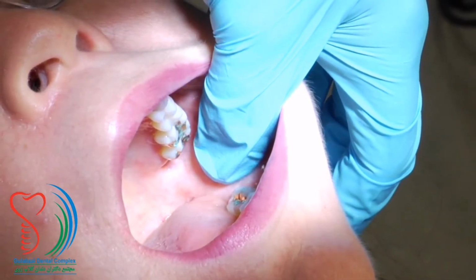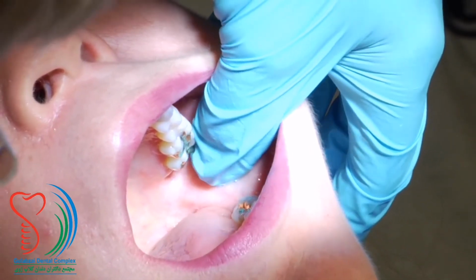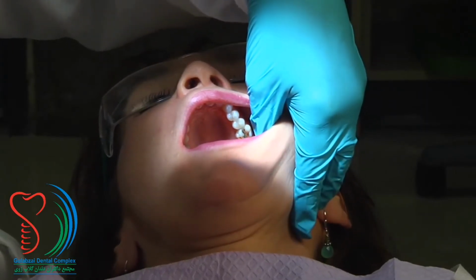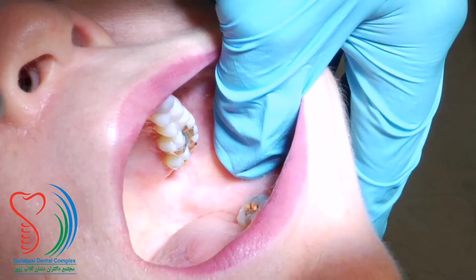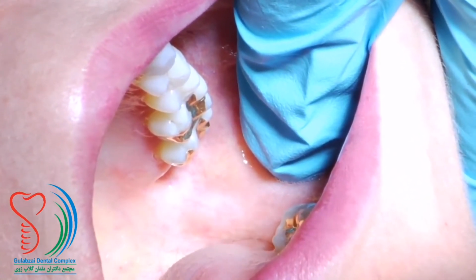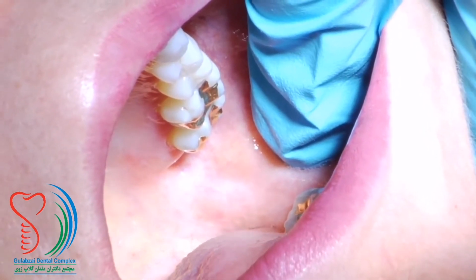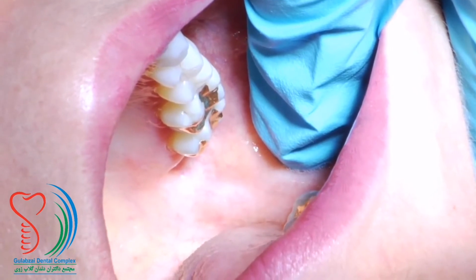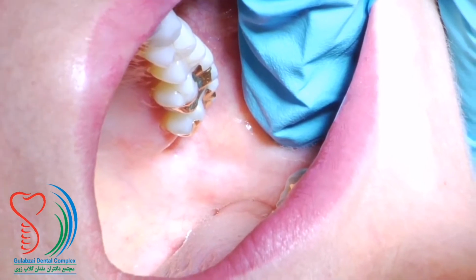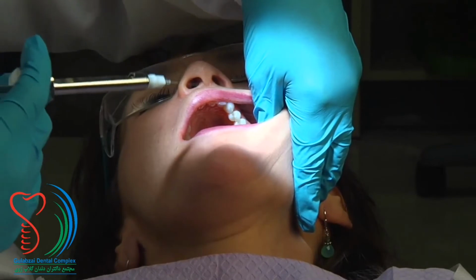Have the patient open widely and palpate the greatest depth of the coronoid notch and move your thumb laterally to make the tissue taut. A lateral movement of the thumb until you reach the external oblique ridge indicates the end point of the thumb positioning. Remember that your penetration site is determined by the greatest depth of the coronoid notch, about 6 to 10 millimeters above the occlusal plane, and is slightly lateral to the pterygomandibular raphe, into the apex of the retromolar triangle.